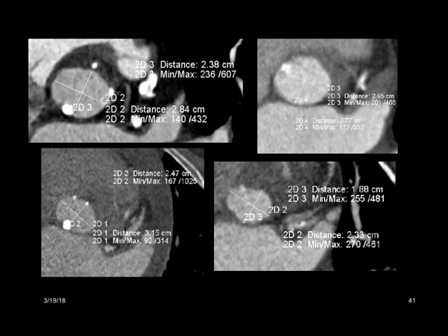Here are examples of different annuli. It's not uncommon to see chunks of calcium within the annulus in these patients. When measuring the perimeter, we bisect the calcium in half. The annulus can vary quite a bit in size from patient to patient and in the degree of roundness versus more elliptical shape.